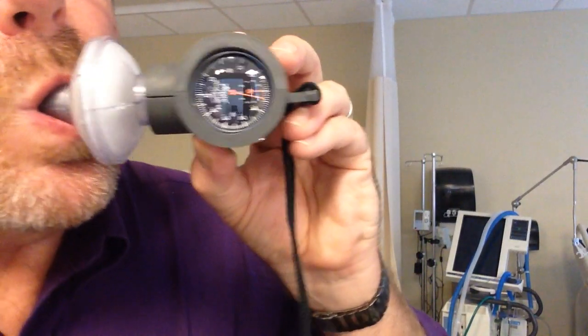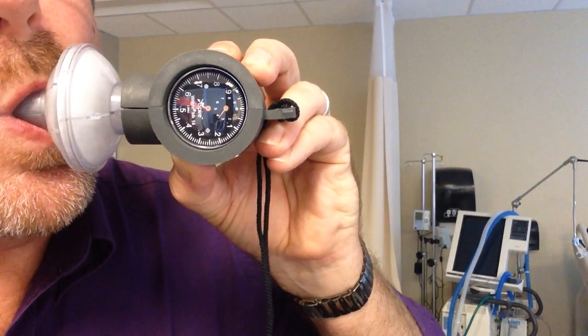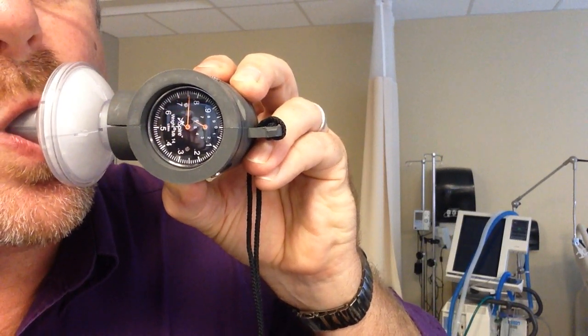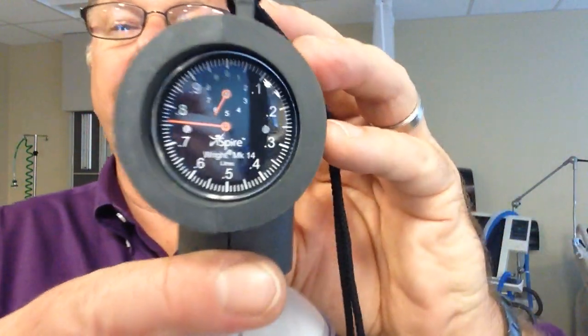So to have the patient do a slow vital capacity, have them inhale as deeply as they can and exhale as fully and as deeply as they can through the device. So what we're going to do is take a big breath in. Okay, that was a full breath.